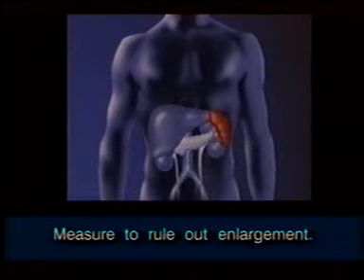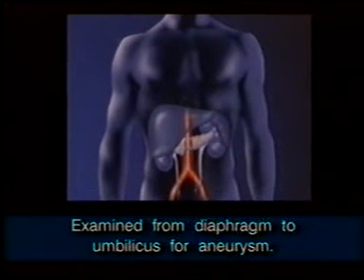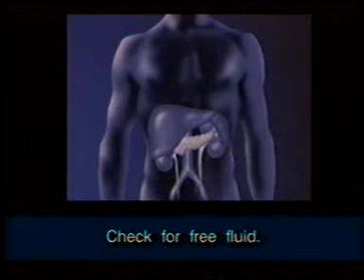The splenic exam involves measuring the spleen to make sure it is not enlarged. The abdominal aortic exam measures the diameter of the entire abdominal aorta from the level of the diaphragm to the level of the umbilicus to rule out an aneurysm. And the basic abdominal exam also includes investigating several areas of the abdomen for the presence of free fluid.